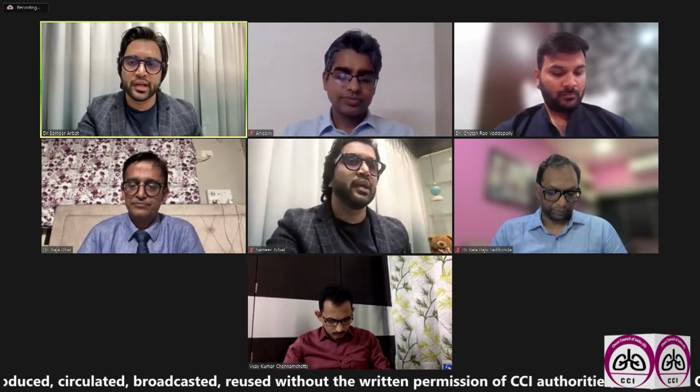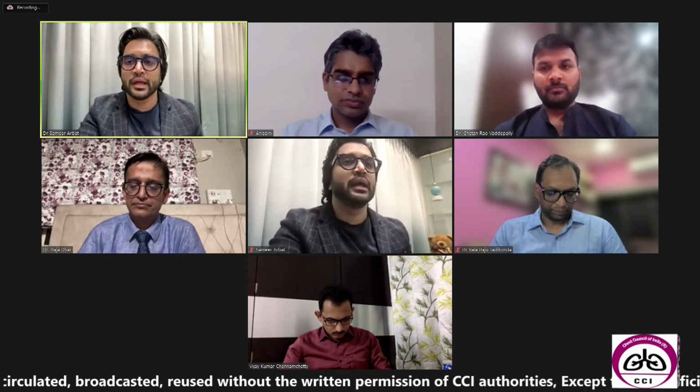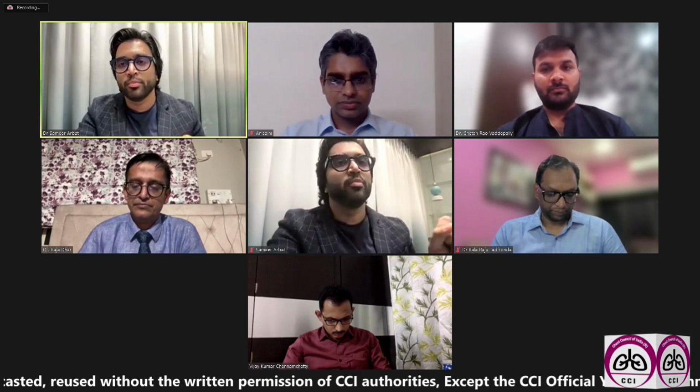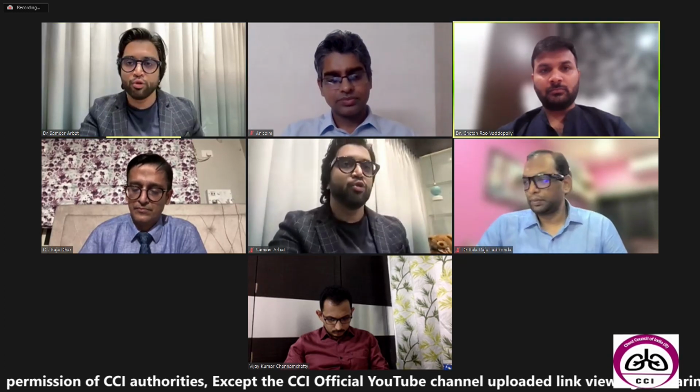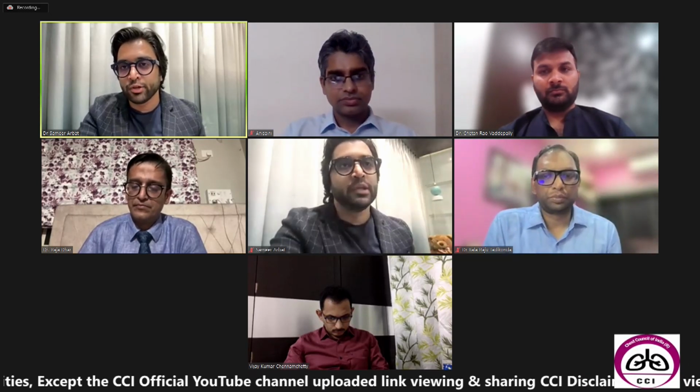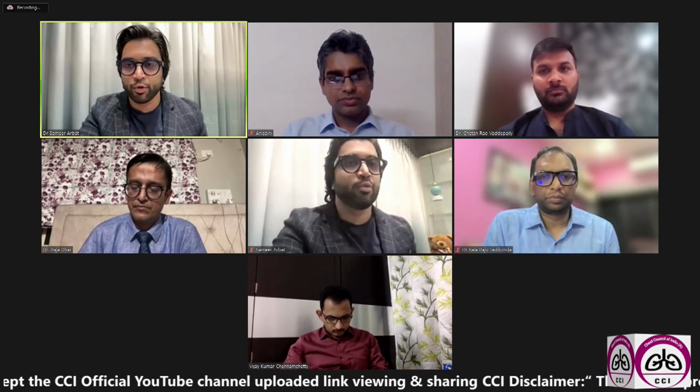And one major worry on a theoretical basis is any kind of perforation that we might cause when we perform a cryo extraction. That is where, by theory and by principle, the cryo will not cause damage to your cartilage. Although when it comes to performing the procedure, I would say it's a misnomer if we say that it's a completely safe procedure.